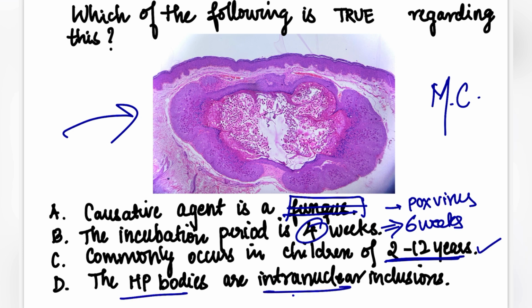And HP bodies are intranuclear? No, they are intracytoplasmic viral inclusions.